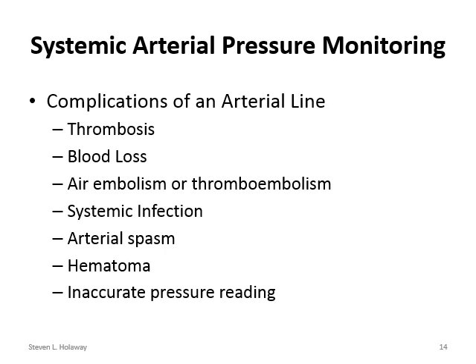And when I say hold pressure, that doesn't mean put a little pressure on for a minute and look at it. That means hold very tight pressure to that site for the full 5 minutes. If they are on anticoagulants, you may need to hold pressure a little bit longer. And then you can get inaccurate pressure readings. And if we're managing medications based on those readings, we can run into complications from that. But again, that's why as a nurse, you're not just looking at the numbers, you're looking at your patient, you're looking at your waveforms to ensure that you have a good waveform, that your readings are accurate for that patient.